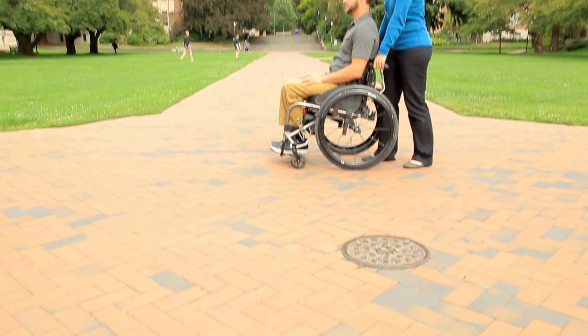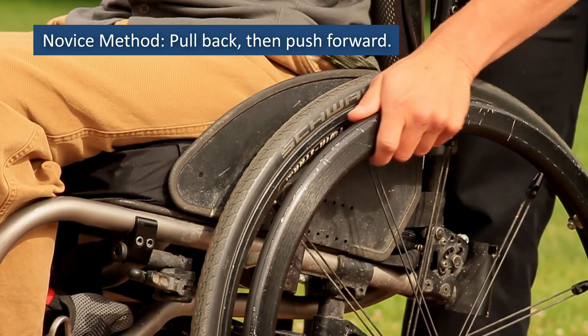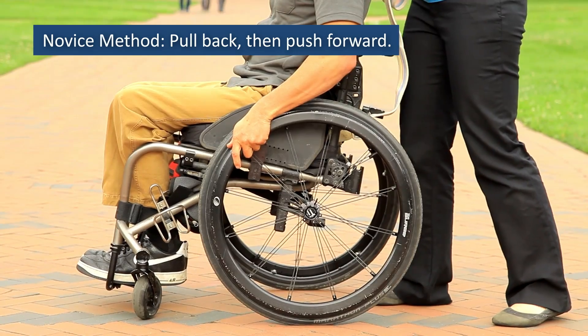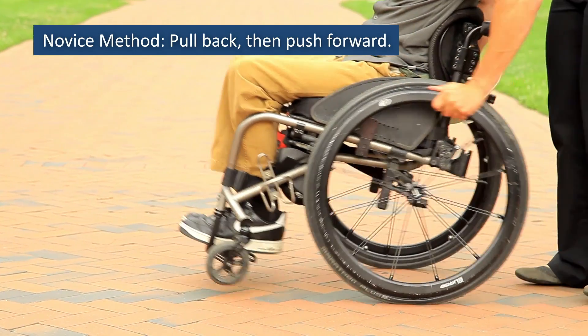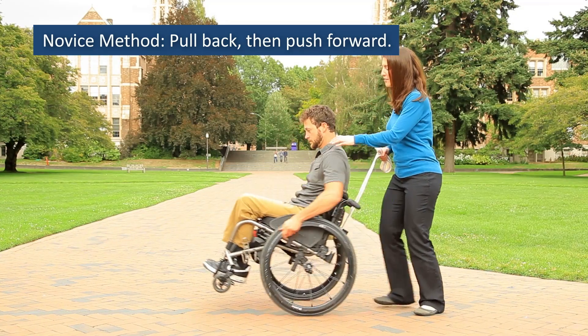Start with the novice method and use a spotter. Place your hands toward the top of the hand rim. Tug briefly and rapidly back on the hand rims, then immediately reverse directions with a short rapid push forward on the hand rims to tilt your wheelchair back into a wheelie.